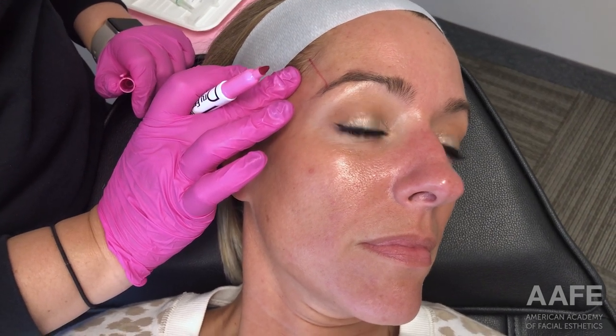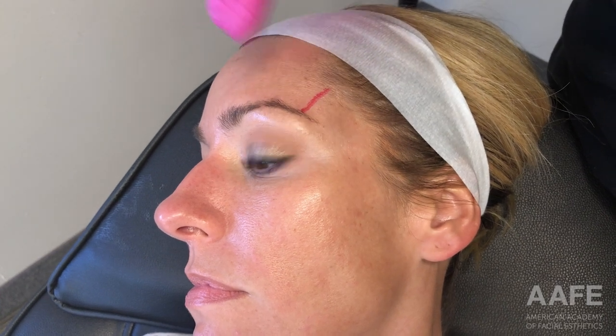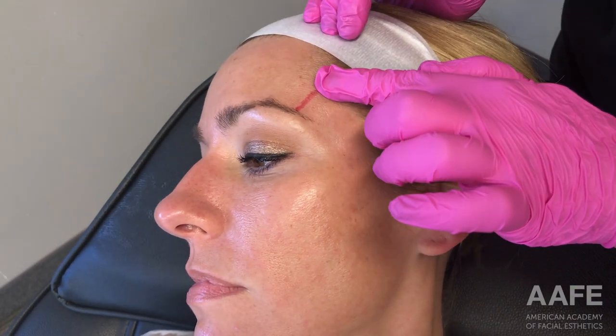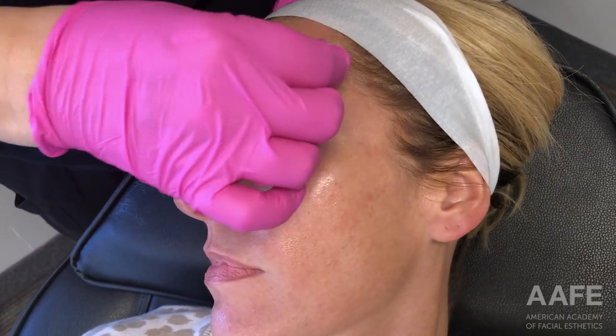For the purpose of today's treatment, we are treating this patient's temples for hollowing, which is unfortunately just a sign of aging. We are using a one-to-one dilution — one part diluent and one part Radiesse. That is not technically considered hyper-dilute; that is considered dilute. Anything greater than a one-to-one dilution is considered hyper-dilute, but for this treatment we are using one-to-one dilute Radiesse.